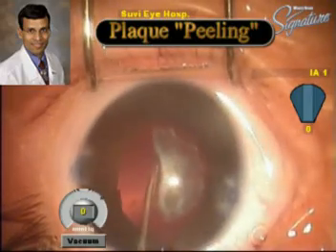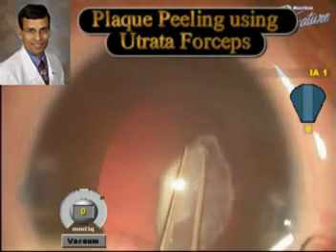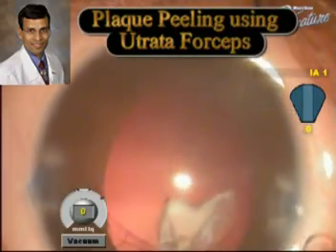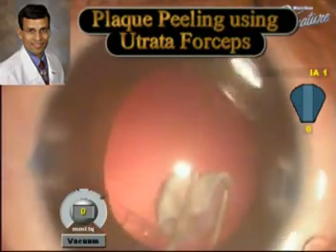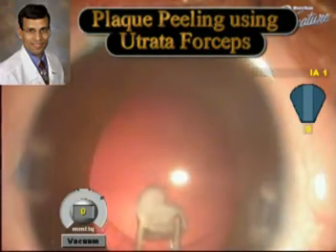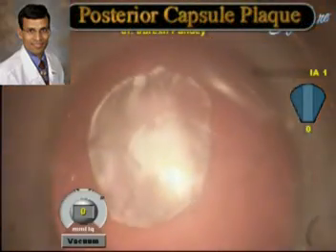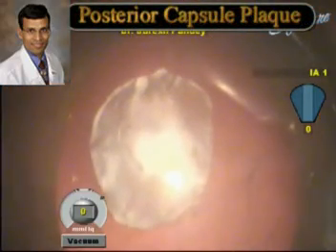A careful plaque peeling is being performed. It goes without saying that these movements have to be very controlled and careful so that we do not stretch the posterior capsule or the zonules too much. And with the help of a lot of generous viscoelastic, the plaque has been peeled, as you can see here.